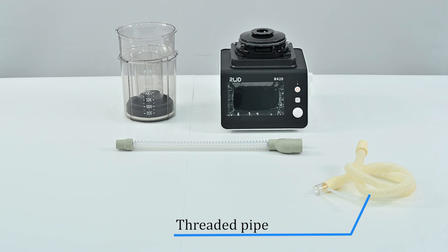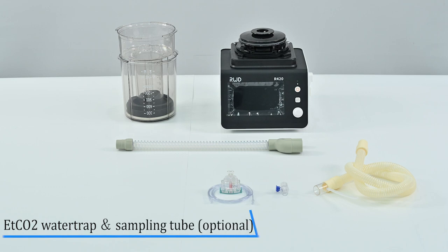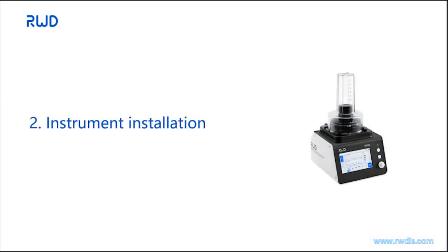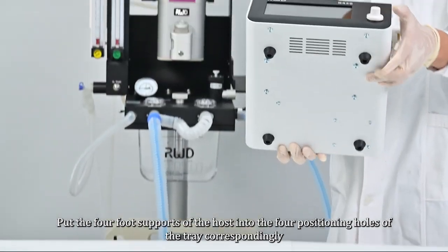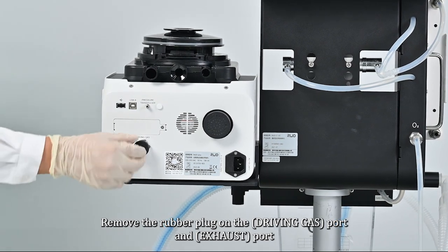Additional contents include: threaded pipe, V60 straight joint (optional), ET CO2 water trap and sampling tube (optional), power cord, user manual, and packing list. Place the four foot supports of the host into the four positioning holes of the tray. Then remove the rubber plug on the driving gas port and exhaust port.